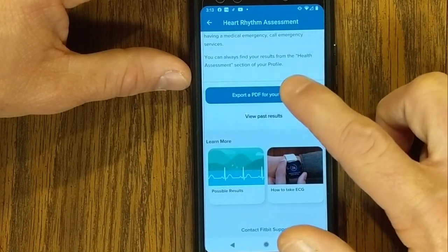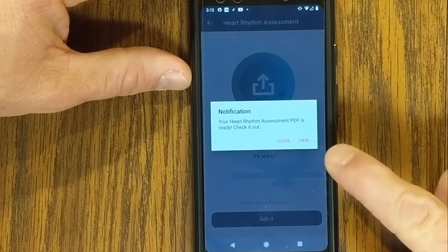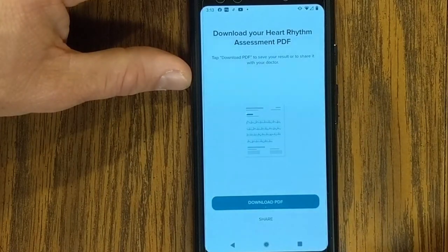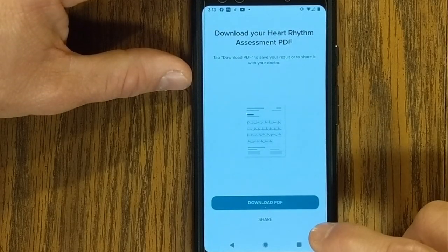Let's export a PDF for my doctor. Exporting a PDF — you'll get a push notification: 'Your assessment is ready, check it out.' Let's go to view. If you're getting some value out of this video, smash that like button as it helps out this video and channel. I can download it or I can share it — let's go to download.